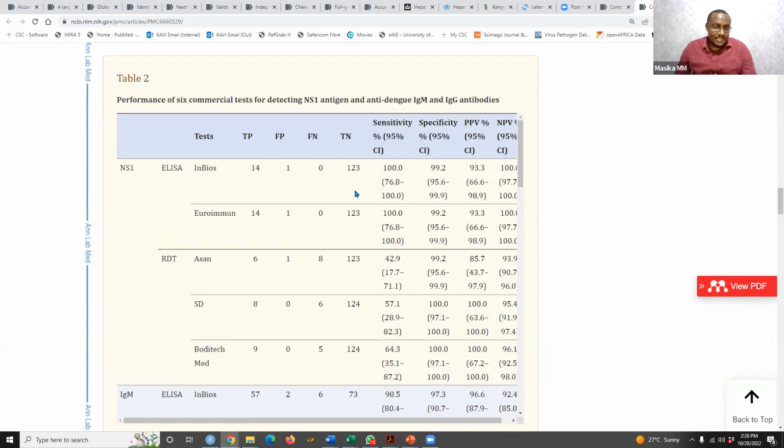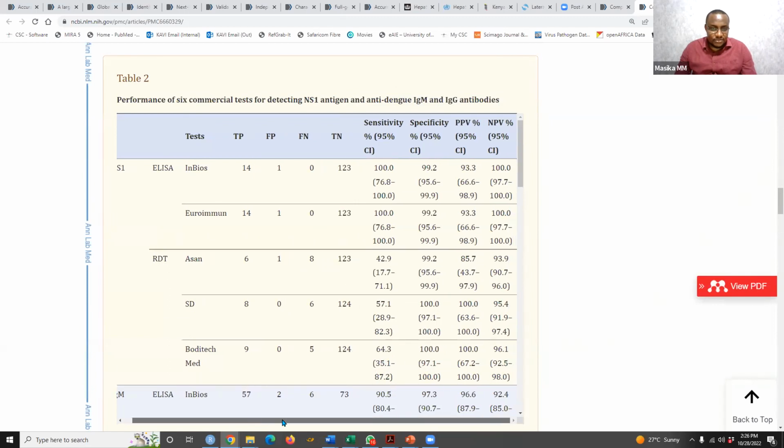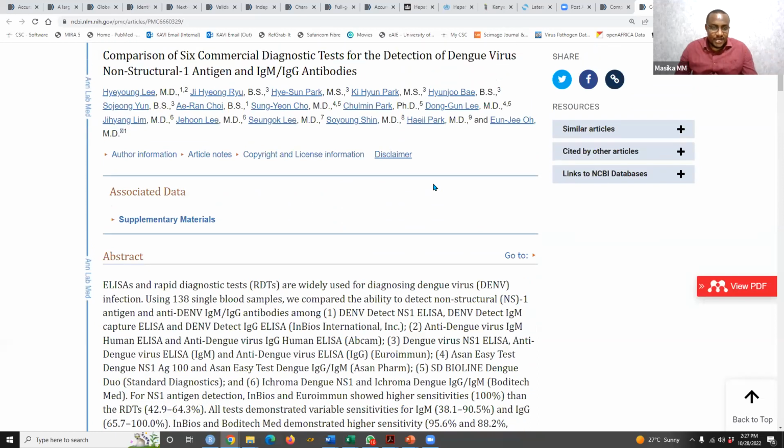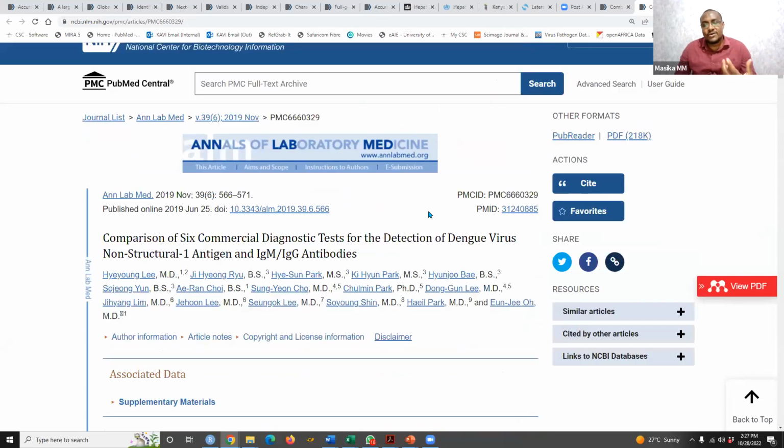And I have summarized this. Actually, I think the same paper I used to summarize by coincidence, if I'm not wrong. So you are looking for sensitivity, specificity, and accuracy, including these ones. So now we'll go back to the presentation and you can see this in a much simplified form. So this is how you can do that for HIV or for another test. It helps you to reduce the amount of time you have to search for a test.